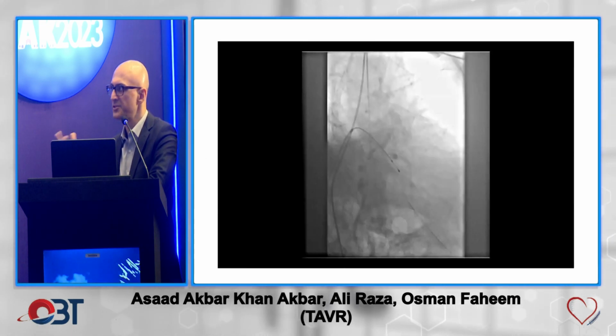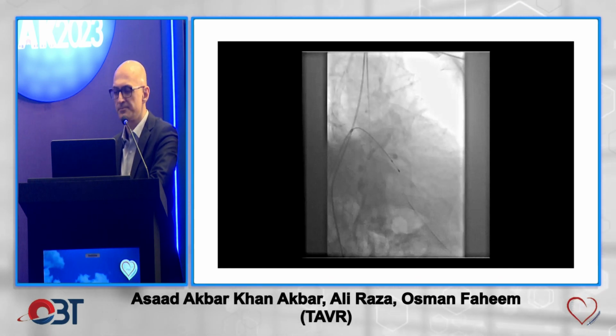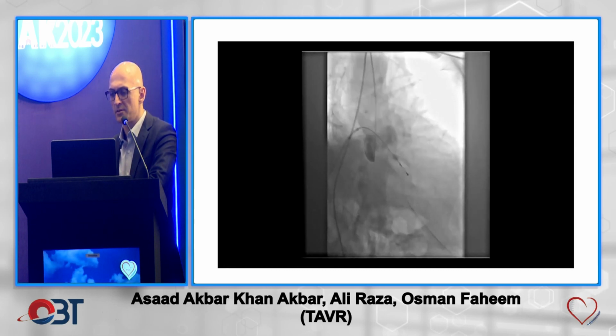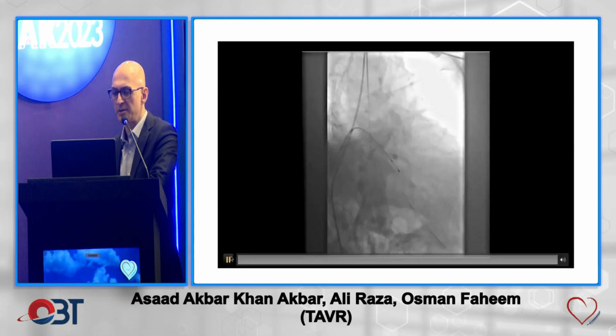We don't use a protection wire. I don't know if you guys use one. We have stopped doing it. Yeah. And so this is us, putting a pigtail in the non-coronary cusp, and we have a pacemaker in.